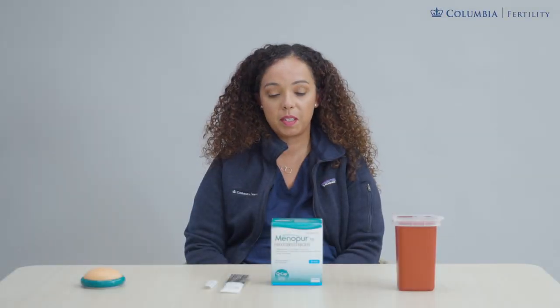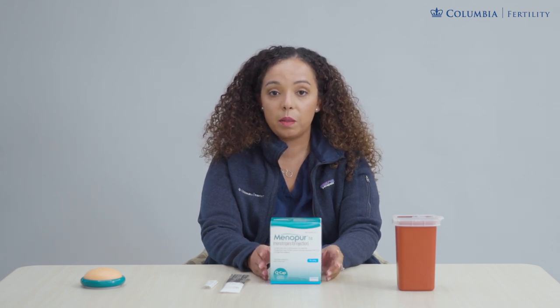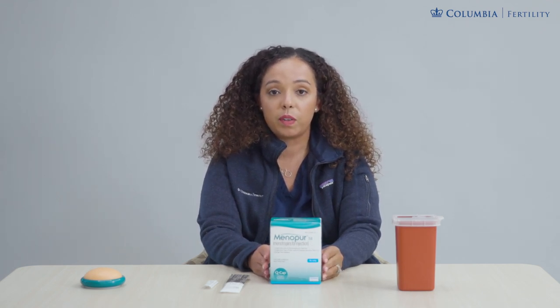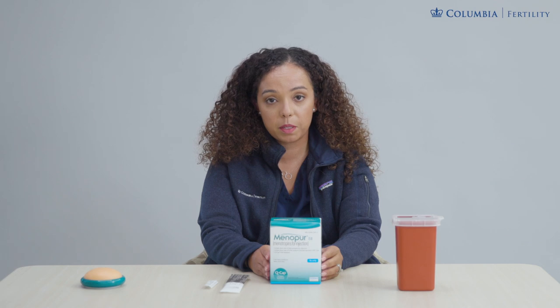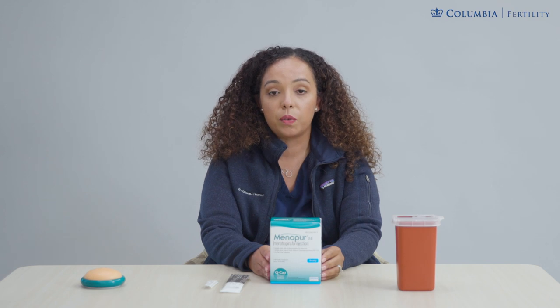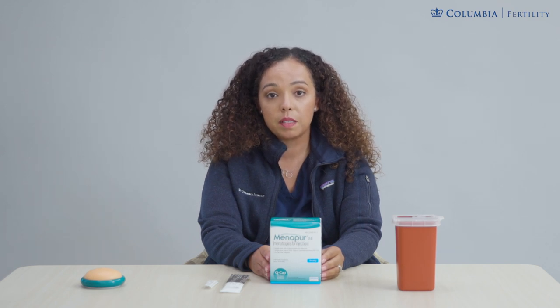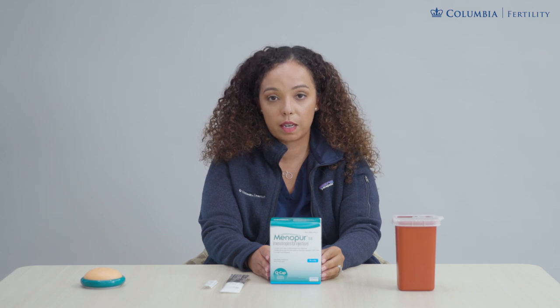In this video you will learn how to dilute your Menopur. Menopur comes in 75 unit vials. In the box of Menopur, the manufacturer provides you with five powder vials, five liquid vials, and five Q-caps. Please note your dose may be different than what is described within this video. For this video I will walk you through how to dilute one powder vial.